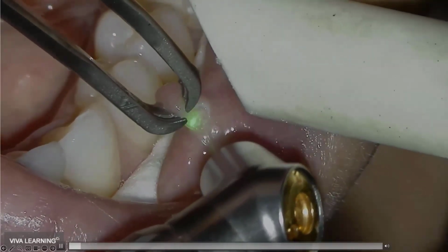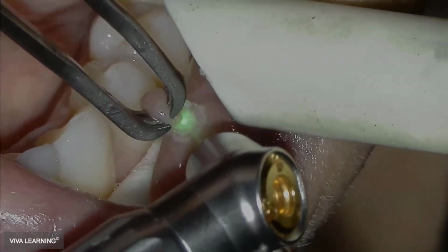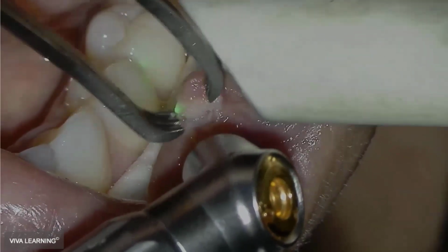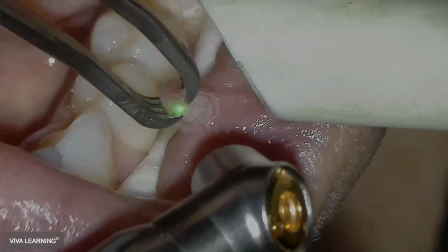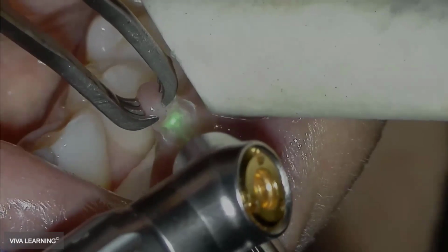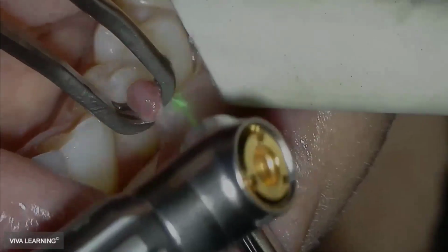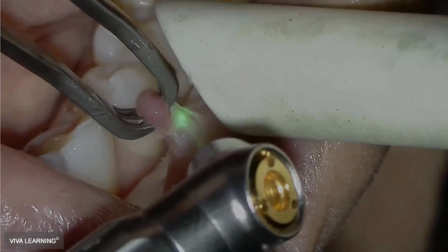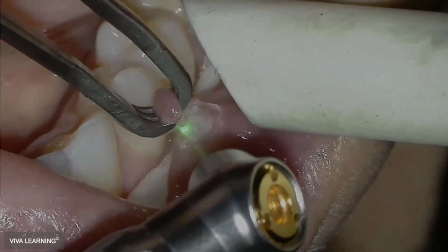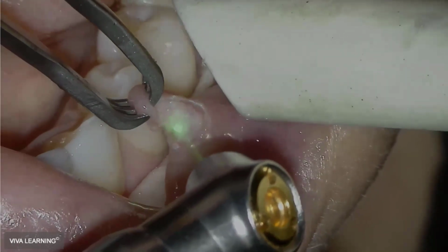But as I pull on that, just the tissue forceps are going to be tender, right? So I'll start going through, and I always have to give myself a hard time because it looks like my hands are shaking, but the microscope is just at a funny angle. Just pulling on that could be a little tender, so we go to the level of maybe a little topical anesthetic. Now, for the next case that I'll show you here, and then again, back to technique, right?